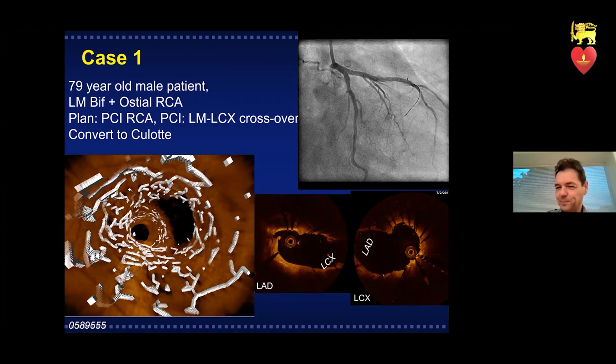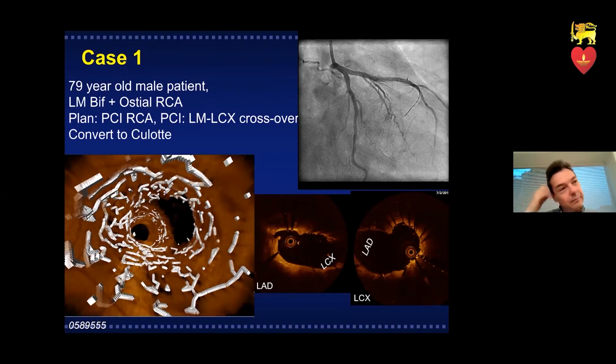Can you explain that? How much? No, there's no resistance at all, because you don't deploy the stent to the maximum. That's what I did last week, and it's very much a balance, because you want to do the POT. The POT should be done not shifting the carina, so proximal to the carina, before rewiring. So at that moment, I had indeed what I said in the beginning: the POT with a low pressure, to get square.